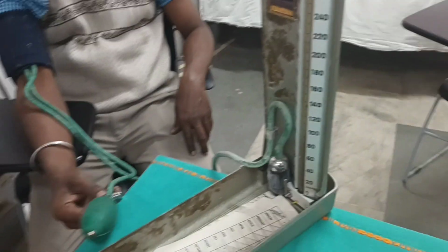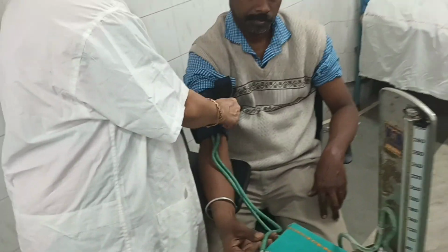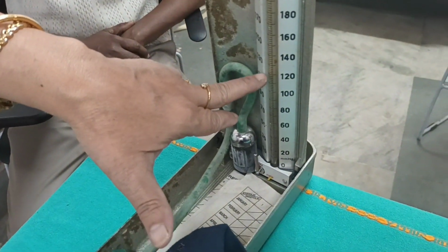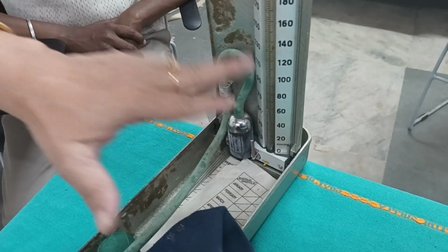Now, while deflating the cuff, I have heard different types of sounds. That is the first Korotkoff sounds. I have heard the taps, then the murmuring sound, then gonging, then muffled, then it disappears. So it came at 115, sorry, 114 millimeter of mercury. I don't say an odd number. 114 millimeter of mercury is the SBP, and the diastolic blood pressure is 74 millimeter of mercury of the subject.